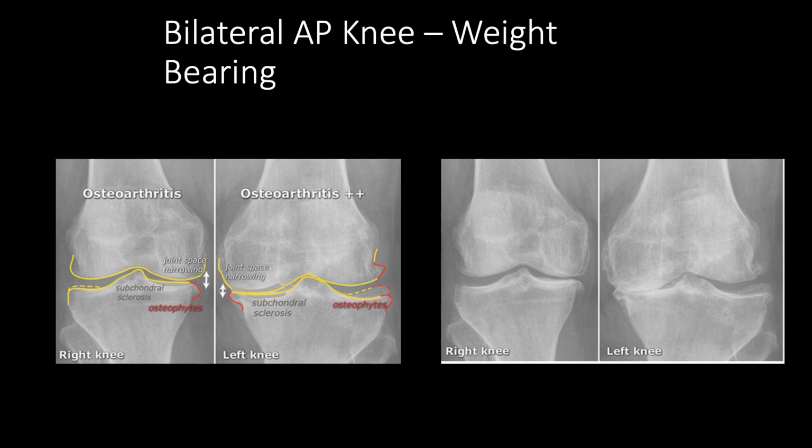So hopefully that gives some clarification on some of these routine views of the knee, along with some of the specialty views that we'll be looking at in regards to pathology in the knee. If you have any questions, feel free to email me, and we'll also be discussing this more in detail with the clinical cases in lecture.